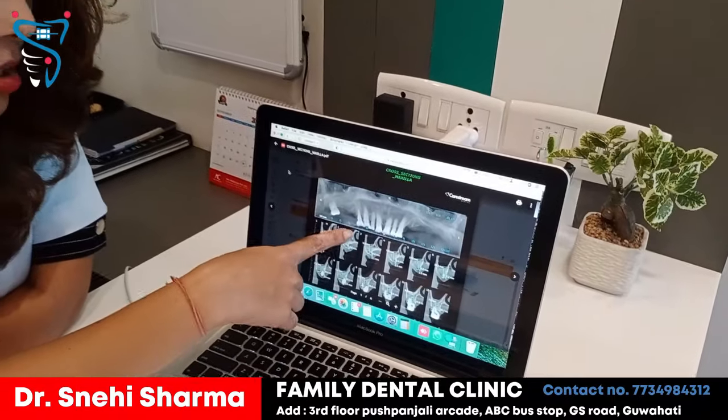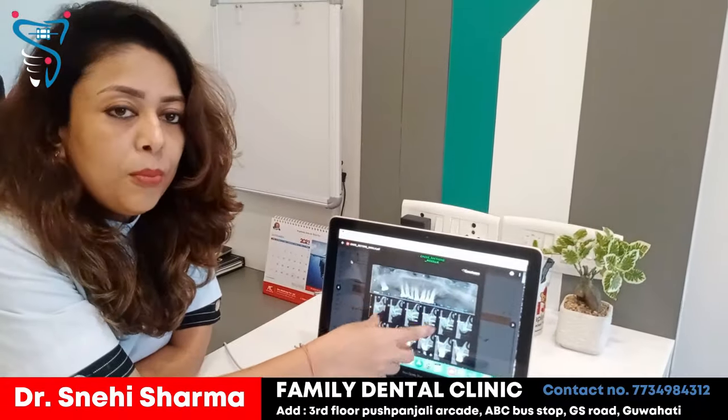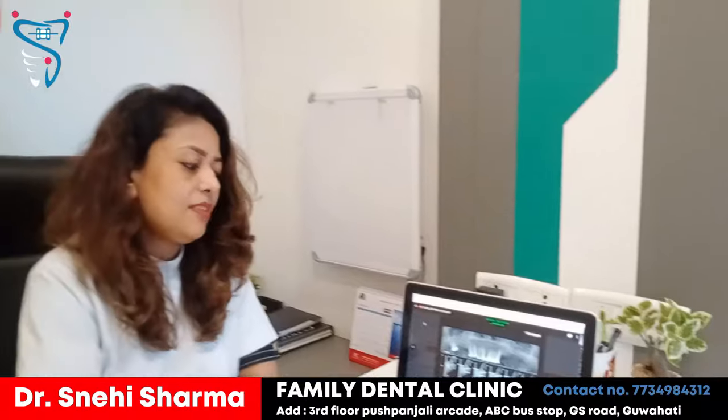I can see the total length, width, and height of the bone that is there, so I can plan to give him an implant that is the size of the bone present. After this, when the patient comes, I'll be giving them anesthesia. I'll raise the flap, place an implant, and then suture it.